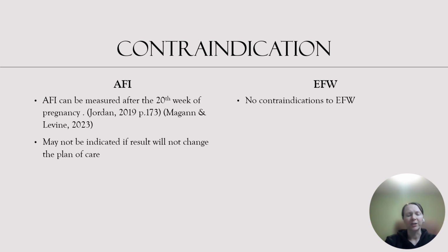All right, our contraindications. As far as AFI, the biggest thing is you can't do an AFI before the 20th week of pregnancy. After that, there's really no contraindication to an AFI. It just may not change your plan of care. And same with EFW. As long as there's no change to your plan of care, there's really not any contraindication of why you should not be doing this.